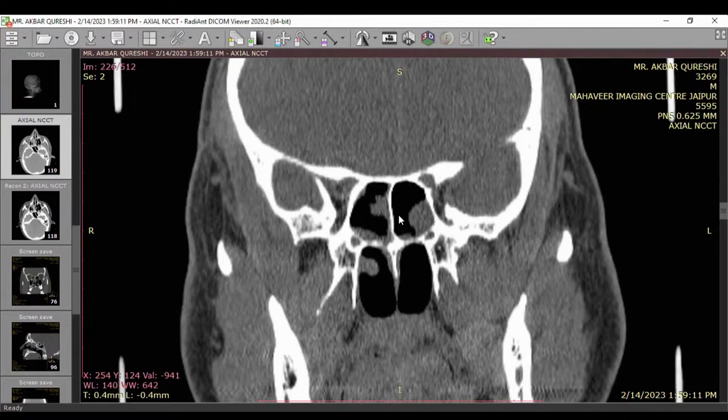Opposite side is concha. Again, you have to open up and it may lead to a floppy turbinate once you remove the lateral part of it. So you may have to do a partial turbinate resection in this case. That will help us open the olfactory area as well.